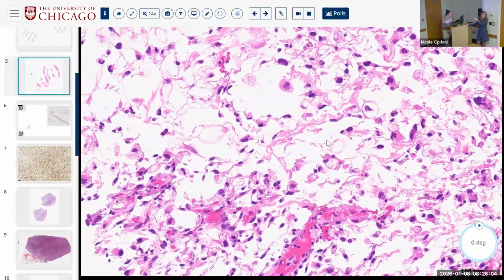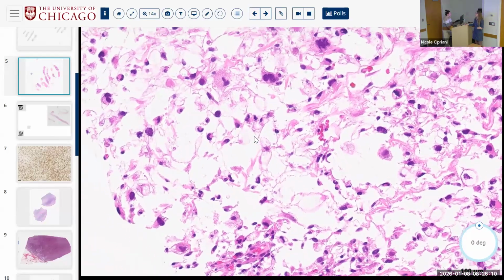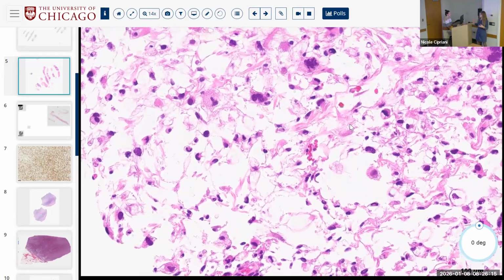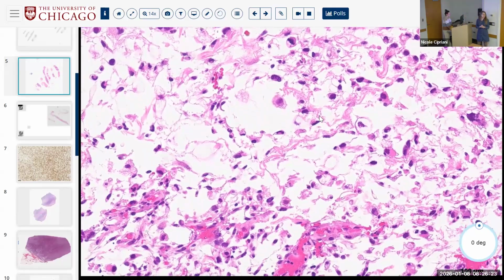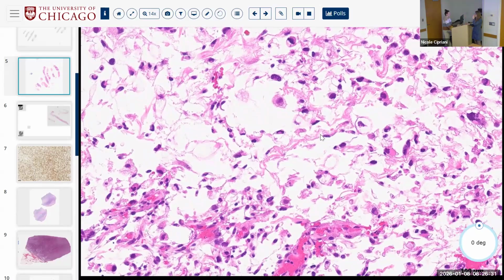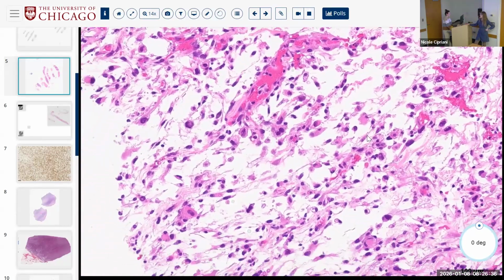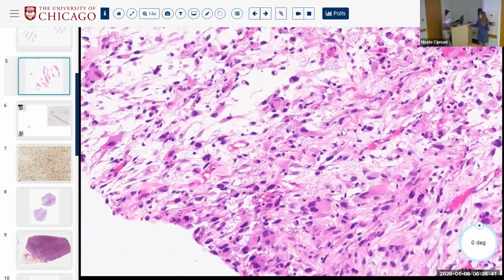Is this fibrillary, collagenous, myxoid? Myxoid, right? So maybe you don't see the connective tissue mucin because the stain's a little too pink. But when you have this rarefaction of the stroma and the cells splayed apart, always think about something quote unquote myxoid, or at least myxoid-like, especially when you have areas where the cells are tighter and areas where the cells are looser like this. And where the cells are looser, think about something myxoid, not epithelial mucin, but connective tissue or stromal mucin.